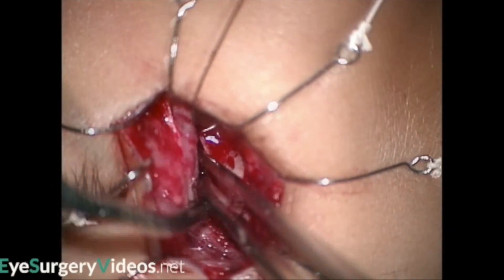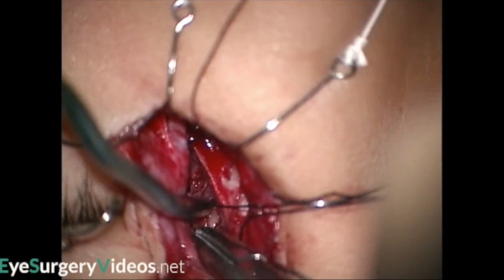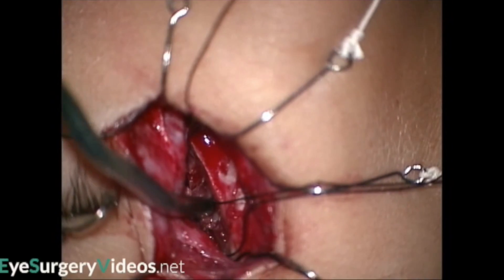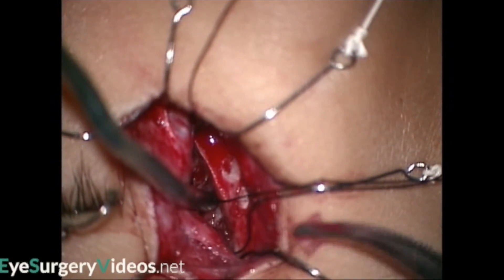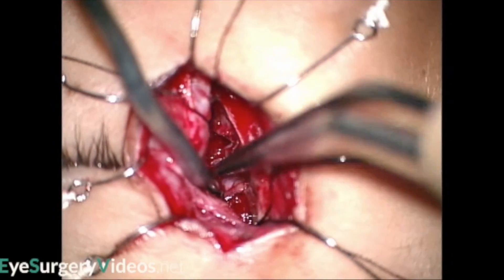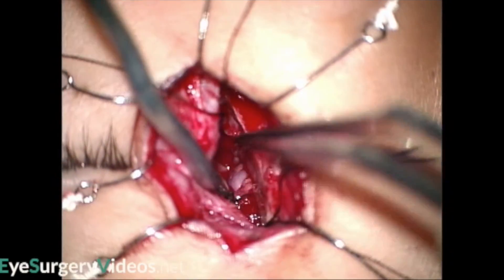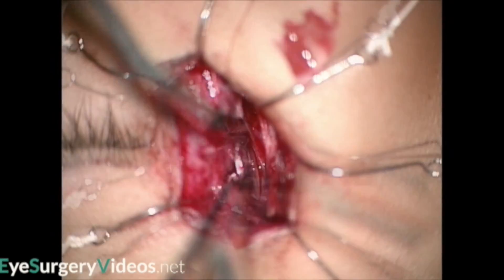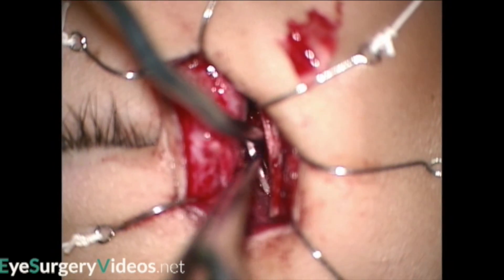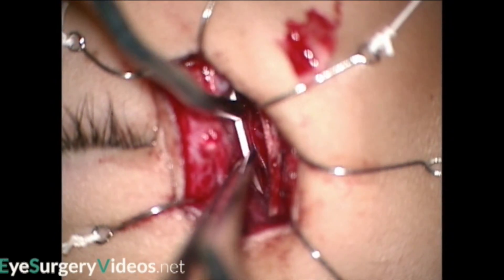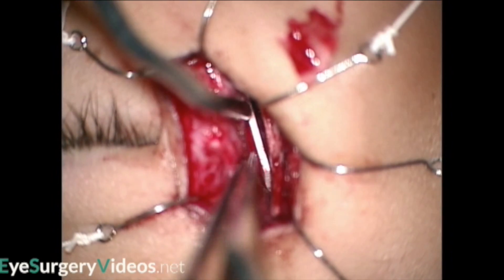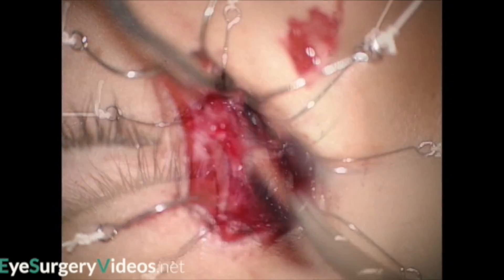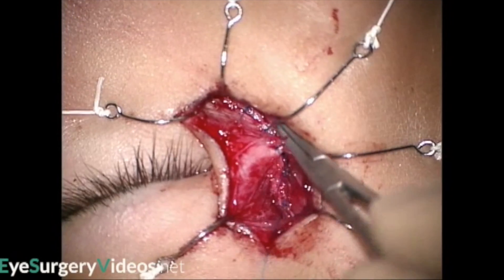As bony fragments are removed, great care must be taken to avoid the anterior ethmoidal artery. In this case, a titanium plate is placed over the fracture site. The periosteum and medial canthal tendon are then repaired, followed by the orbicularis and skin, aiming for an excellent cosmetic outcome.